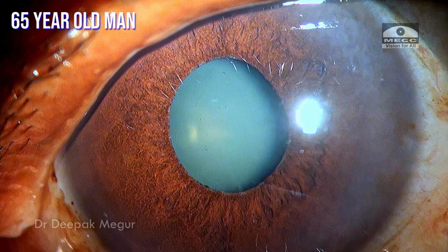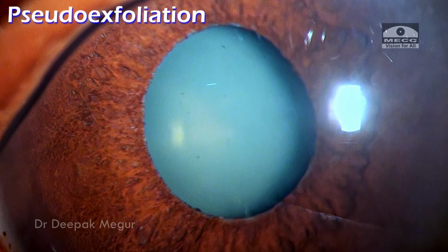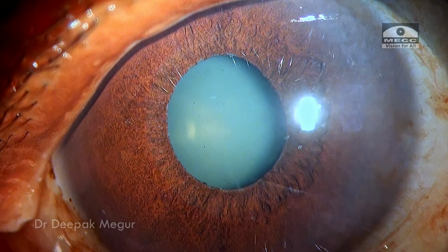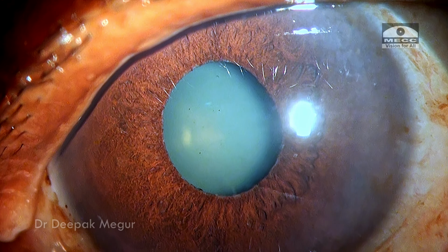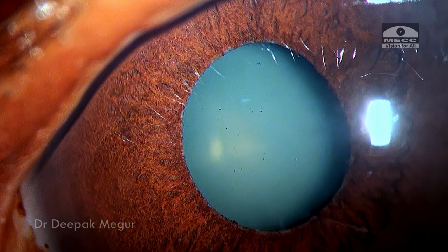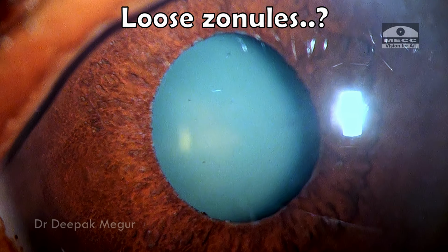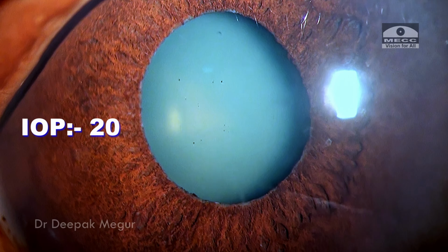Hi, he is a 65-year-old gentleman who has pseudoexfoliation and an immature cataract. Nuclear sclerosis is around grade 2 and he is posted for surgery. The pupil is moderately dilating, and because of pseudoexfoliation, we expect some loose zonules as well. Preoperatively, the intraocular pressure is around 20s in both the eyes.